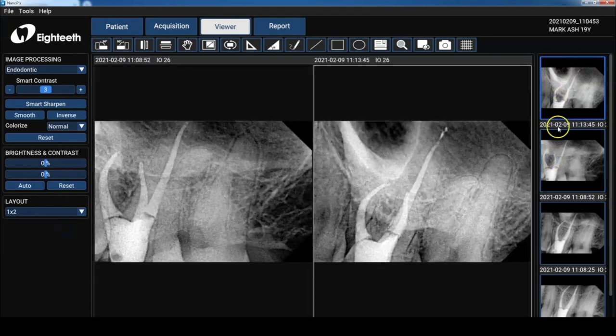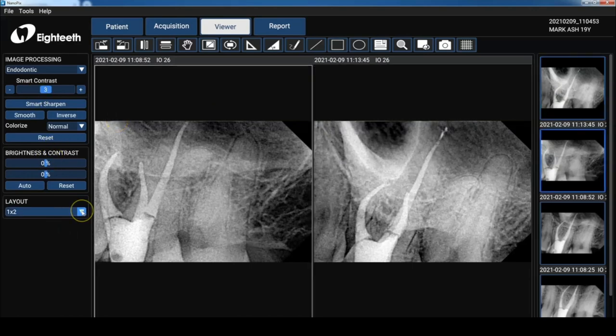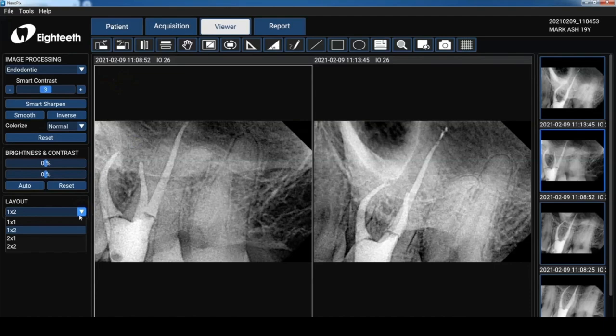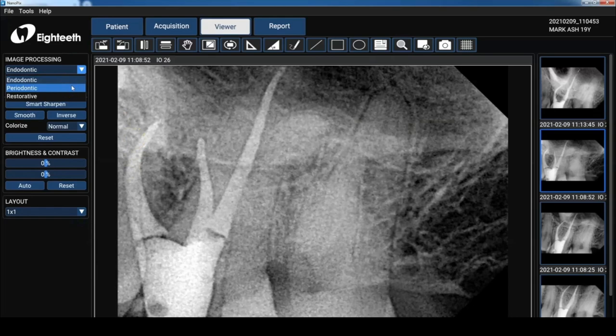So I've got it set for two by one, but you can totally change it to however many images you want. We'll set it to one by one. Now there's a perio and we have a restorative filter. I'm going to set that back to endo.